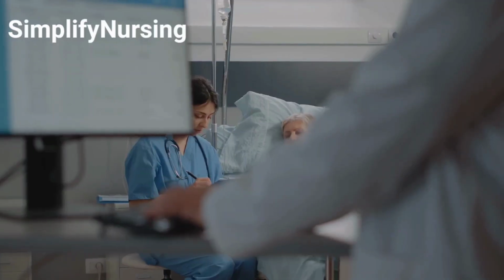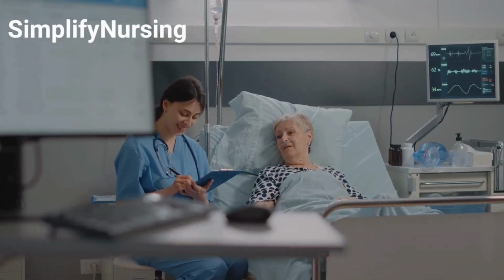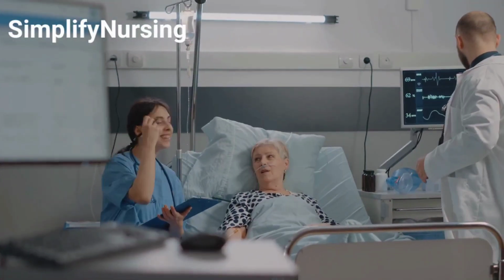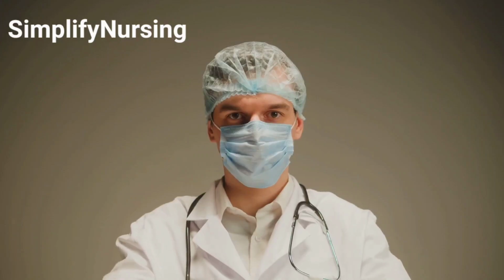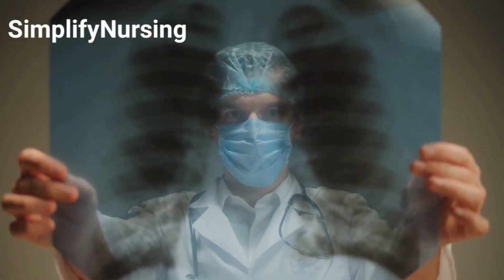Indications for removal of a chest tube include the resolution of the underlying condition, for example, pneumothorax or pleural effusion. Additionally, minimal or no drainage for a specified period and improved respiratory status are key indicators.